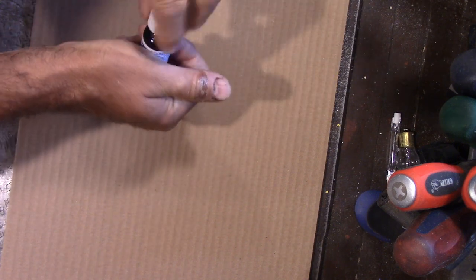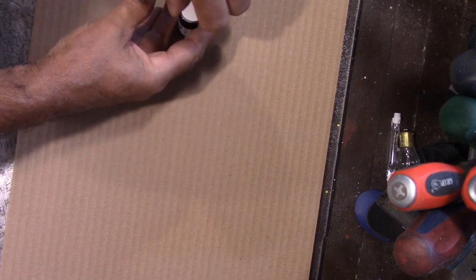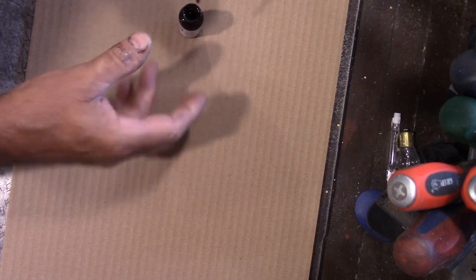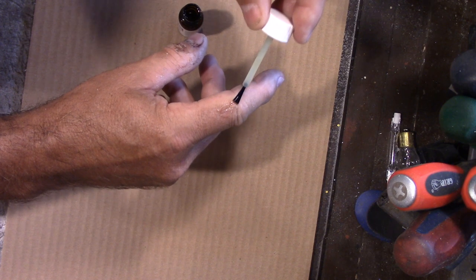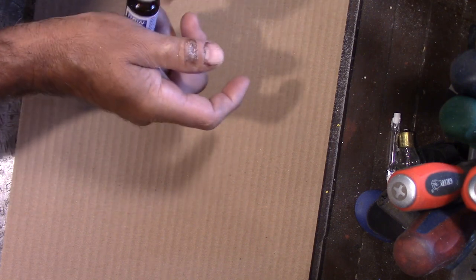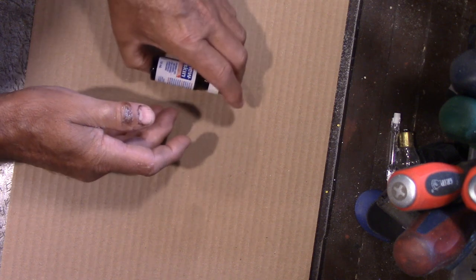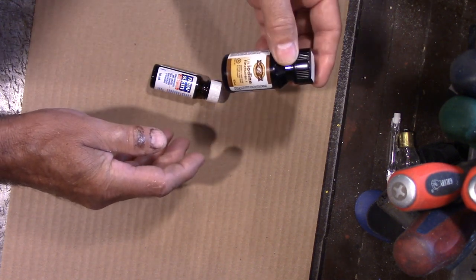I'll just demonstrate — you put two coats on. When you open up the bottle, the first thing you'll notice is it smells exactly like nail polish remover. And all you do is just put it on like this. The first coating will sting — it does sting, not a lot, but it stings. This stings a lot worse, or you can just douse it with alcohol.